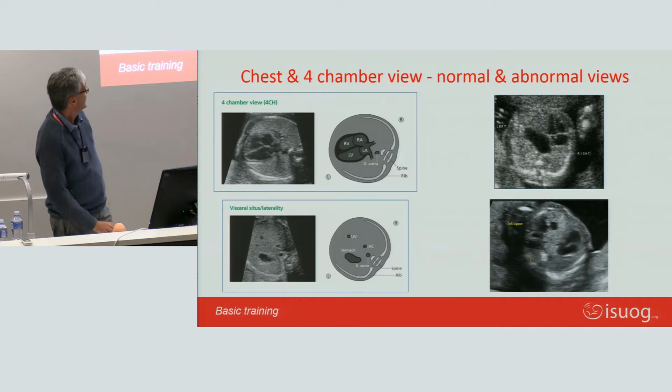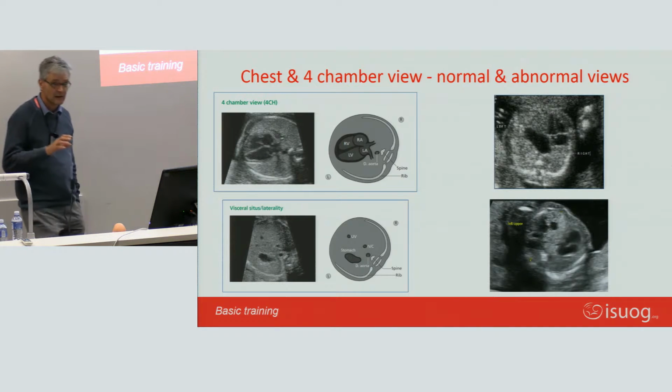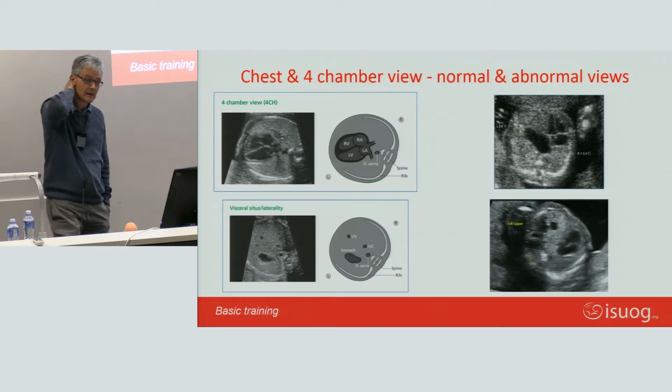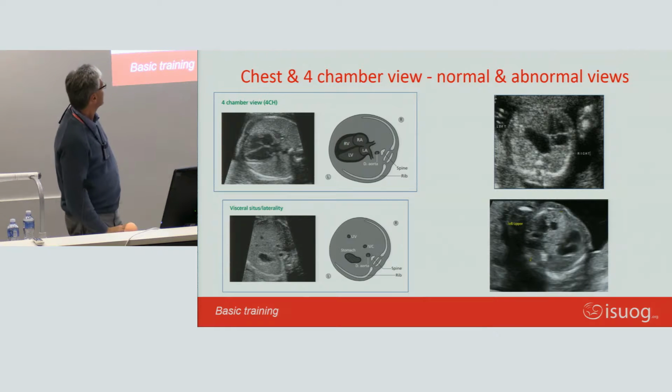Okay. Chest. Now, if you start scanning, you think of the heart, you just want to run away because it's just so complicated. But it's really, again, very simple. There's a heart. The heart fills.